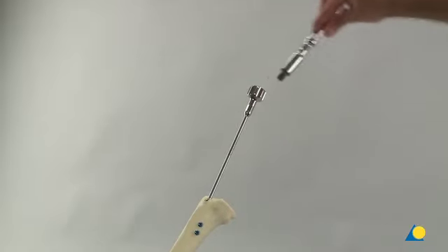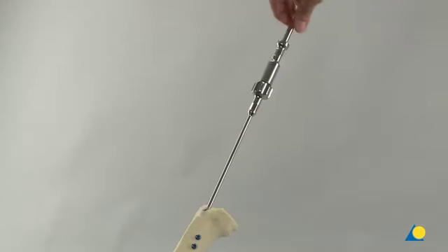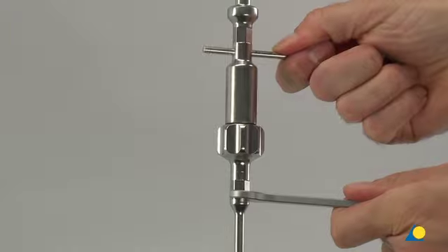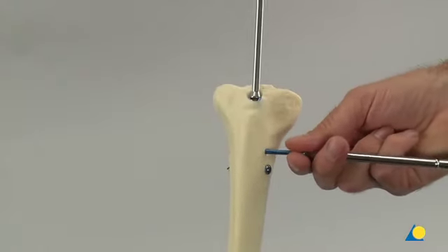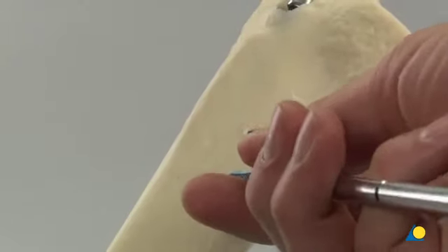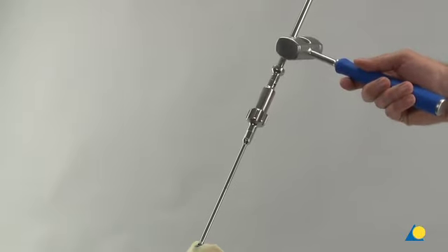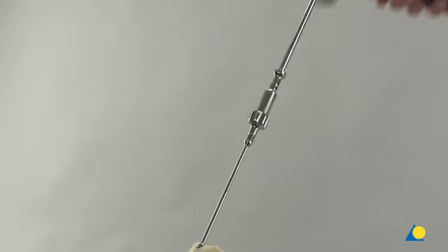The hammer guide is attached to the extraction screw and tightened with the pin wrench. The T25 star drive screwdriver is used to remove the locking screws. The combined hammer is attached to the hammer guide, and the nail is extracted with gentle blows using the back slap technique.